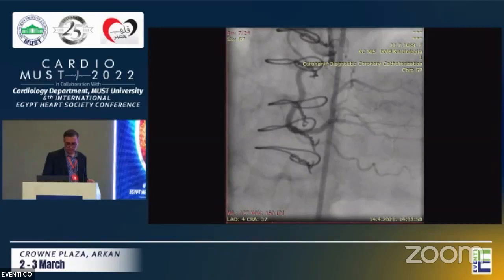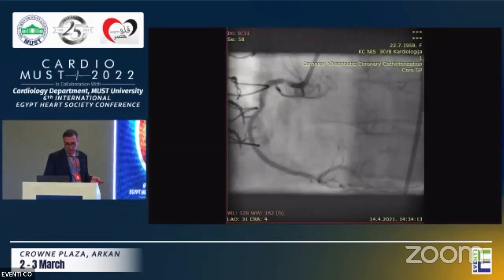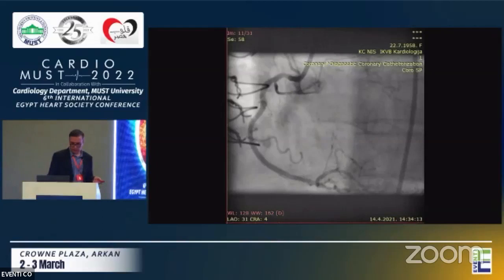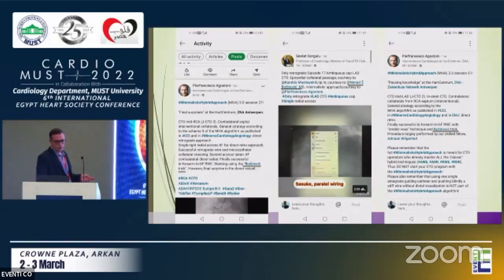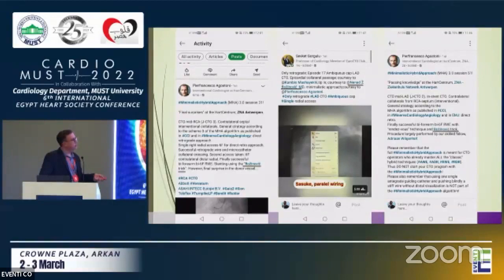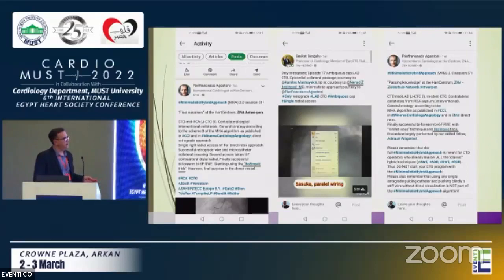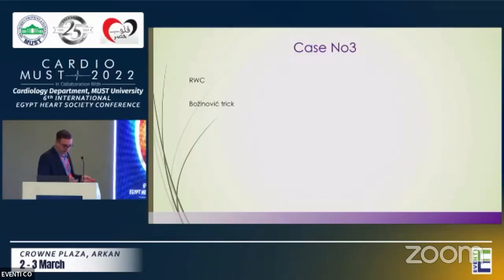This is my final result in AP cranial, and this is my final result in LAO 30. When I told other people what I had performed, Dr. Pierre Francesco Agostoni named this procedure the Bozinovic Trick. Also, Sehket Gorgulu uses this in his procedures. After that, Pierre Francesco put some cases on LinkedIn with the Bozinovic Trick. This is case number three — my final case.